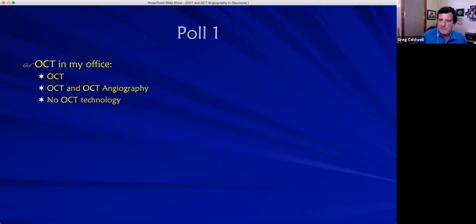And Joe, right off the bat, we have a polling question here. I'm just kind of curious, the audience tonight in their office, do they have OCT, OCT angiography, both? Or do we have no OCT technology? So just curious here. OCT only, OCT and OCT angiography, and no OCT technology.